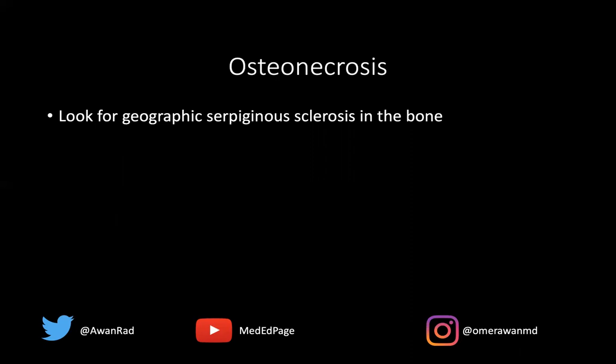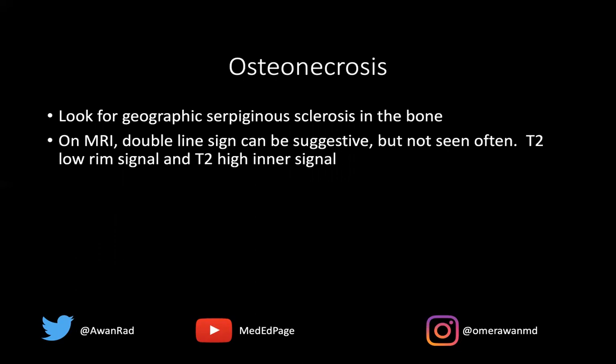The key feature on imaging is to look for that geographic serpiginous sclerosis in the bone — that's the typical key for osteonecrosis. On MRI, the double line sign can be very suggestive, though it's only seen in maybe 10% to 20% of cases. You typically have a T2 low rim and a T2 inner brighter signal. The key on MRI is really to look for preservation of fat — if you see geographic abnormal signal with normal fat in that region, that's highly indicative of osteonecrosis or AVN.